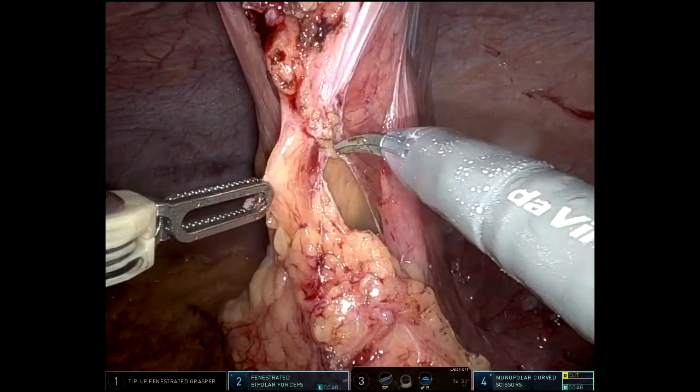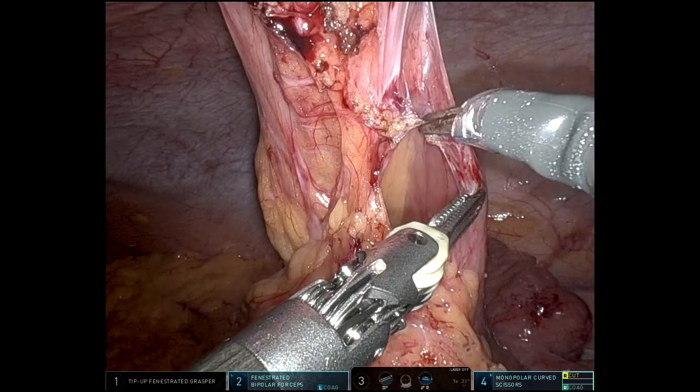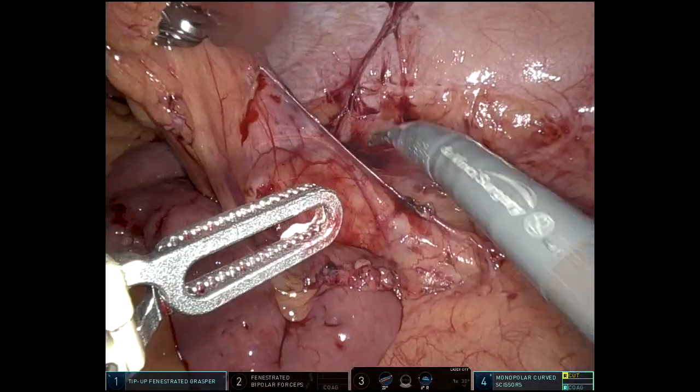I skipped over the vast majority of the lysis of adhesions just to try to move to the meat of the case. Right now, obviously, this is the colostomy. I'm taking down those small bowel adhesions and the omental adhesions to the colostomy.